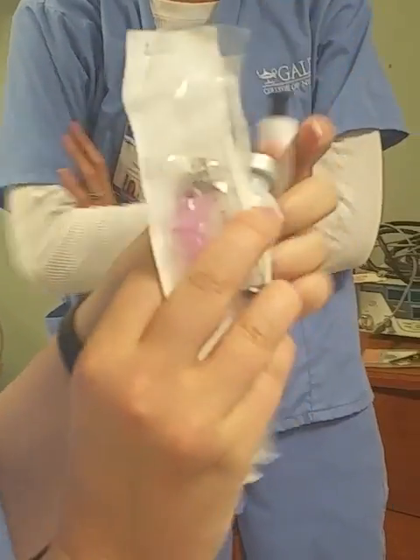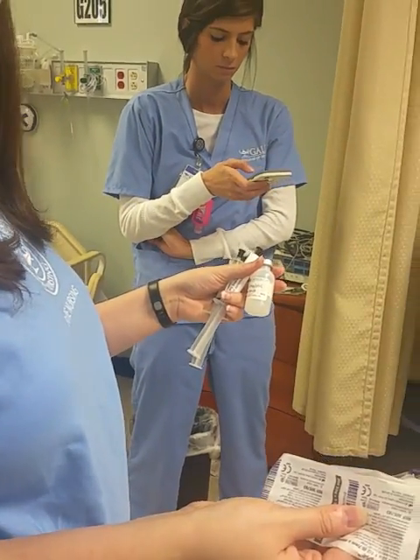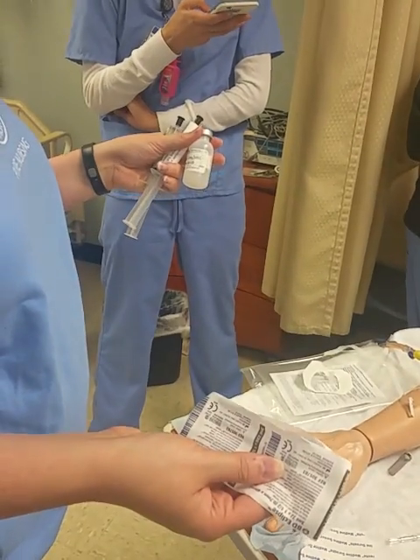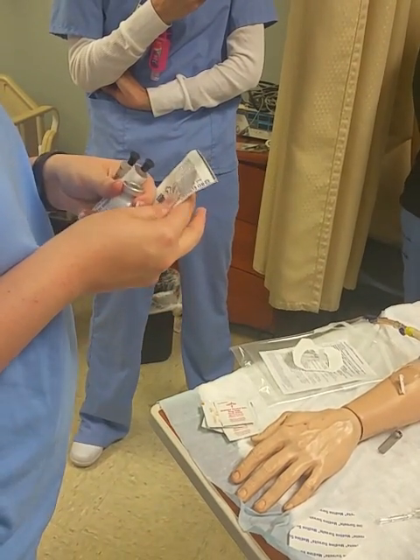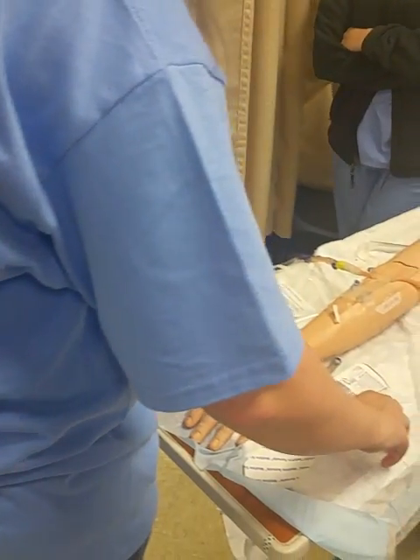Two flushes, a med and a syringe. That's all you're going to need for your IV push demo, because the IV's already in. Do you have that out, or do we have to scavenge for it? They'll be out. Okay. You'll have an order, and it'll tell you what med you're given.